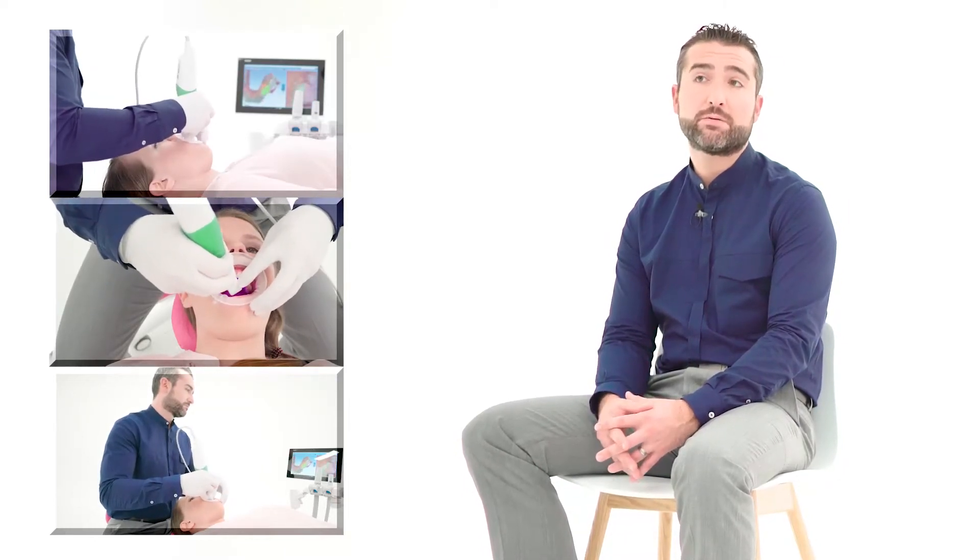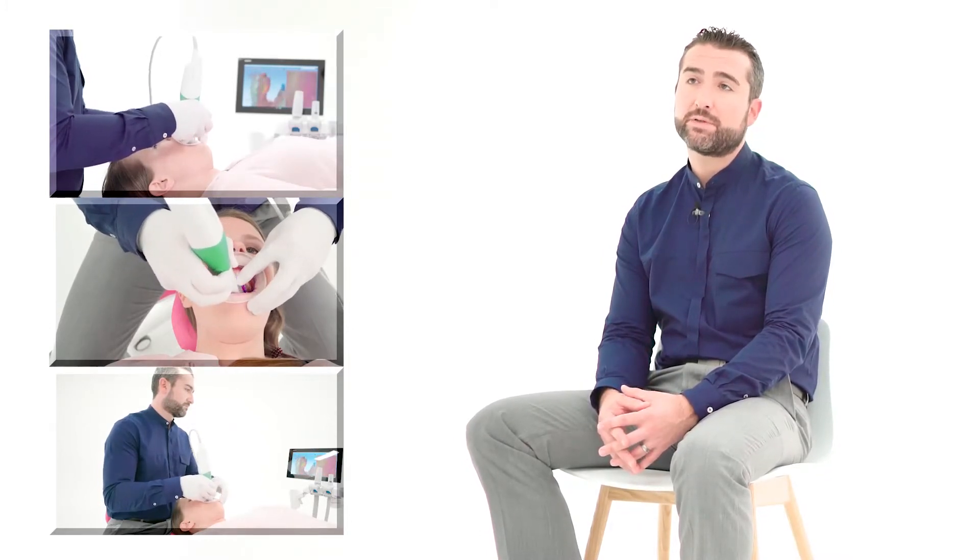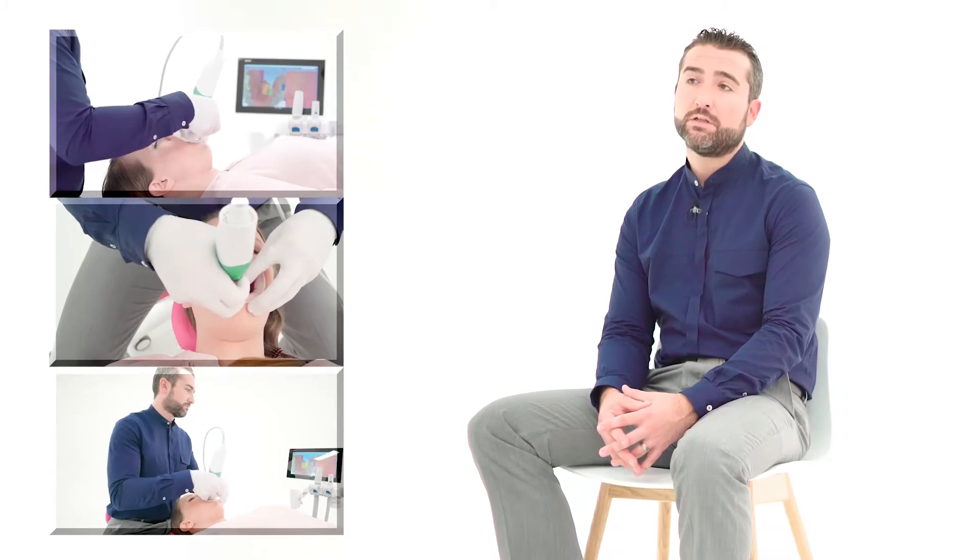Now we're talking under a minute for a full arch. Full upper and lower arch and a bite in two minutes — that's something unique and special that we're able to achieve, so speed is very important.